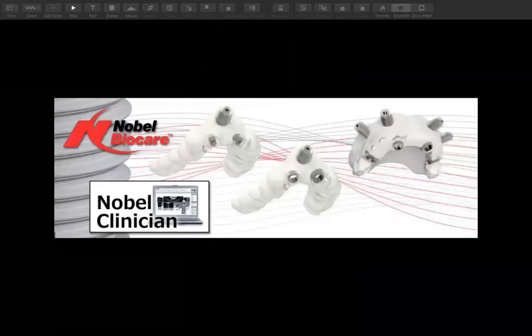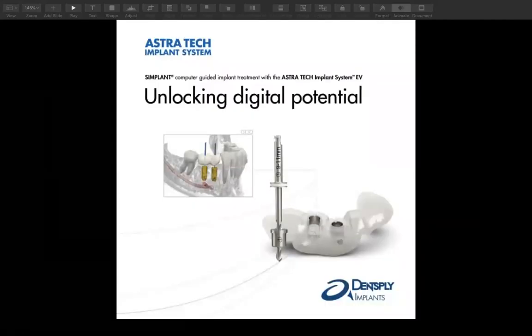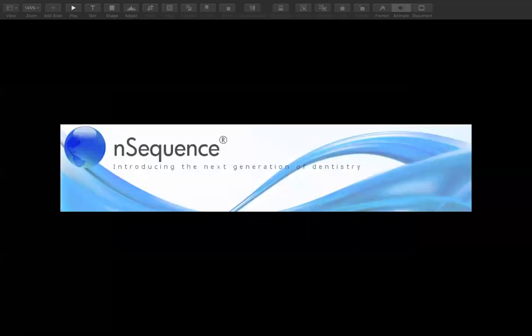So without doing this typical conversion, there are other ways of doing it. There are companies out there that now offer fully guided systems. You can have a prosthesis basically ready to go and pick up without even having the patient bite into it. It's all based off the CT scans and models and doing these fully guided systems. Nobel has that to offer. Implant has a fully guided system.